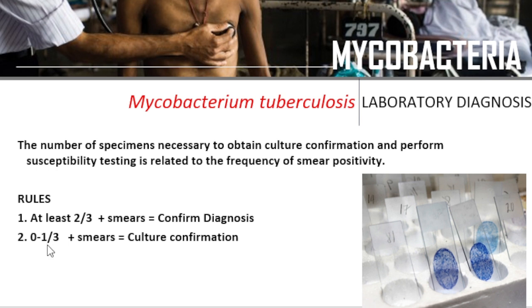Now, if 0 to 1 out of 3 specimens is positive, whether only one sample or none is positive, it needs culture for confirmation. Still, the gold standard is the culture for confirmation.